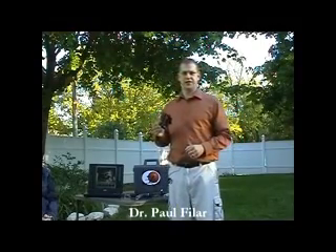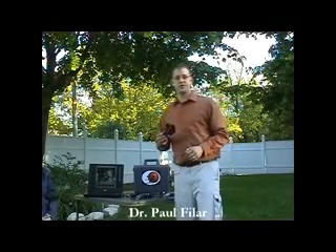Thank you for your interest in ProVision's Panoptic Anterior Segment and Retinal Camera Attachment. We are outdoors to demonstrate that you can take excellent anterior segment and retinal photos anywhere your scope of practice can take you — whether you are in your exam room, at a satellite clinic, working in a nursing home, going on a mission trip, or other remote locations.